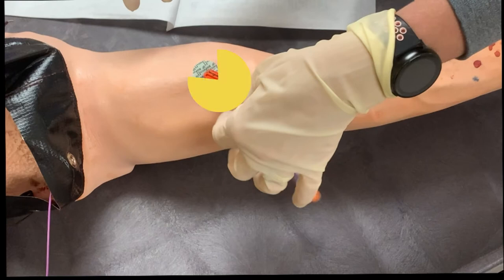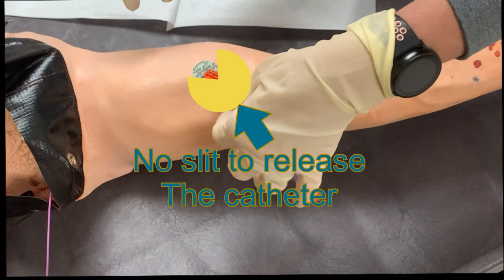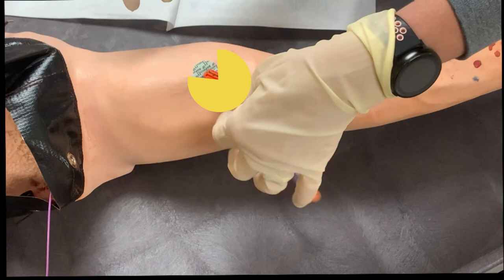If the slit is positioned opposite the catheter, when you pull the dressing up from the bottom, the biopatch will still be wrapped around the catheter and potentially cause you to accidentally pull the catheter out of place. Even if you manage to keep the catheter in place, you'll need to put extra effort into removing the biopatch from around the catheter. To make every dressing removal easier, make sure to consistently place the biopatch slit in line with the catheter.